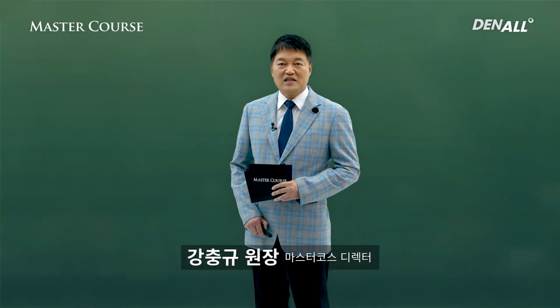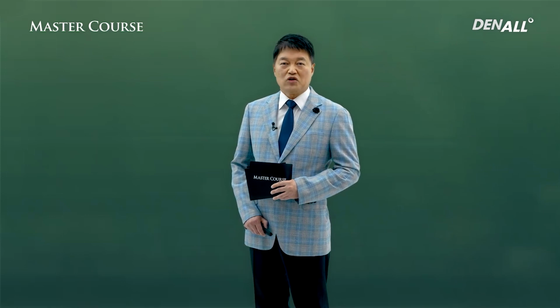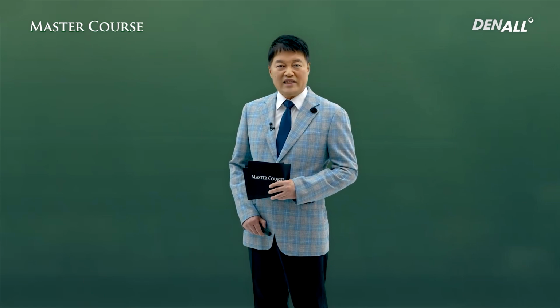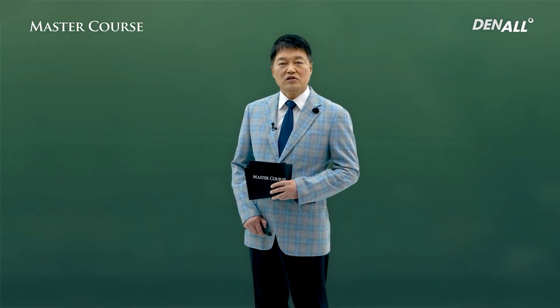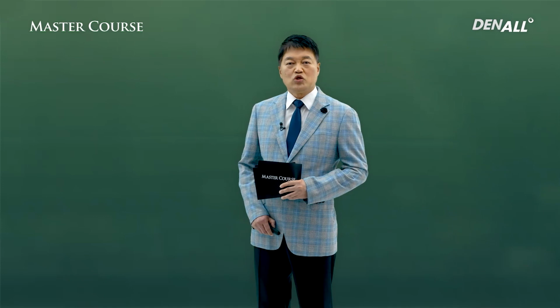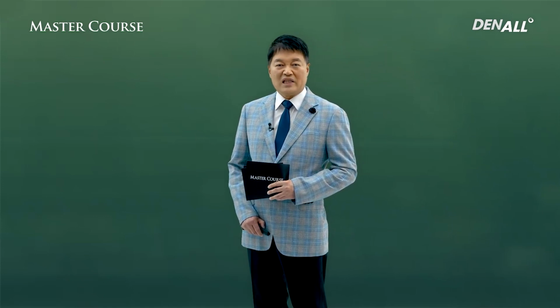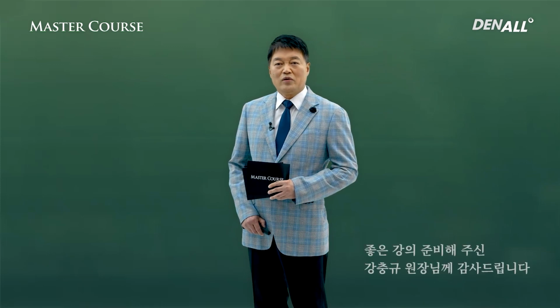An appropriate treatment plan reduces time, and functional and aesthetic satisfaction can be increased. Accurate position and appropriate depths can lead to natural and aesthetic results. Therefore, when you do treatment planning, you need to think of fixtures, length, diameter, position, and angle to get successful surgery results. You need to keep these in mind and apply them in actual surgery to get good results.